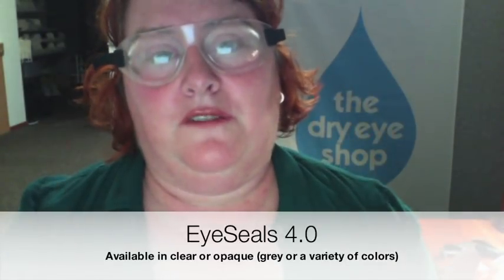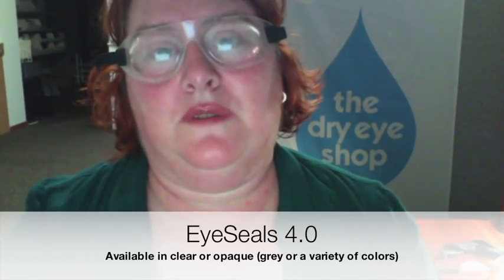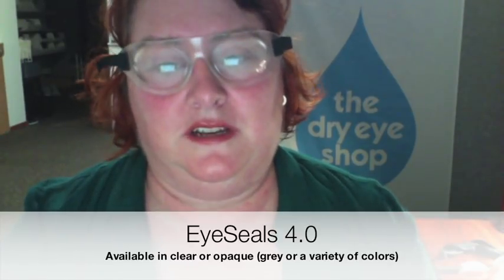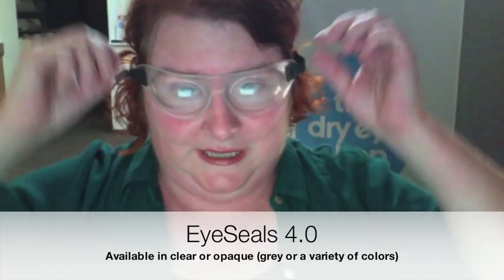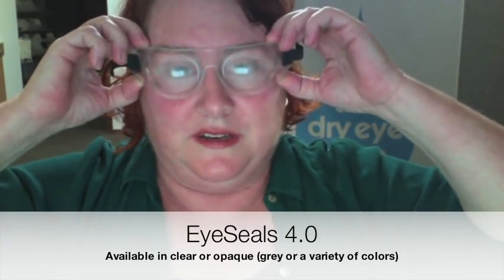You may be looking at a different solution, but it's a pretty close seal all the way around. It is reasonably comfortable for sleeping in. We use this for dry eye in general all the time, especially when people can't tolerate having something touch their lids. They're a little pricey but they do have a one-year manufacturer warranty in case of tearing.